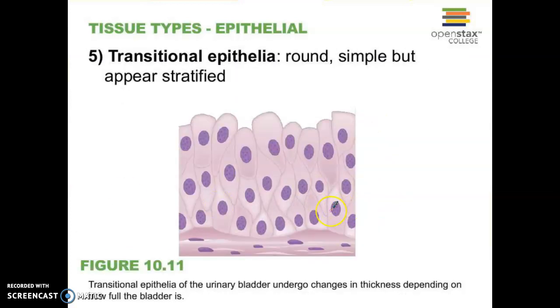Transitional epithelial, and again, if you just find a way, I think, to connect these definitions with kind of the images. So transitional, like these are transitioning from epithelial cells that are up here. They almost look like, to me, like balloons floating up, like here's one and it floats up to here. So they're transitioning to that surface from deeper down.